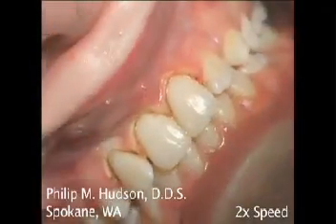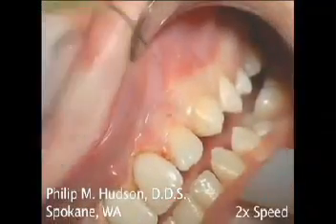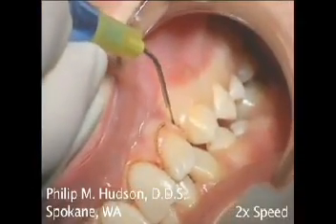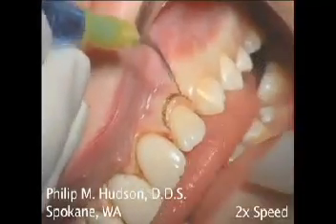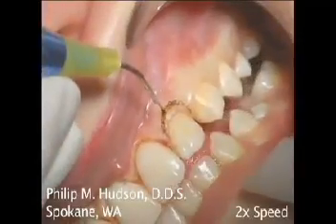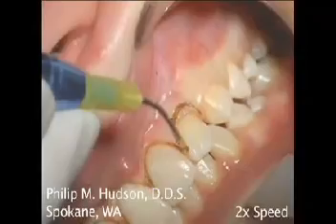In the aesthetic zone, Dr. Hudson notes the following 4 keys. 1. Keep in mind not only the height of contour of the free gingival margin of each individual tooth, but the relationship of its margin to its immediate neighbors and to the contralateral tooth. 2. Exposure of the anatomical crowns to the cemento-enamel junction with bilateral symmetry is the clinical endpoint of treatment.